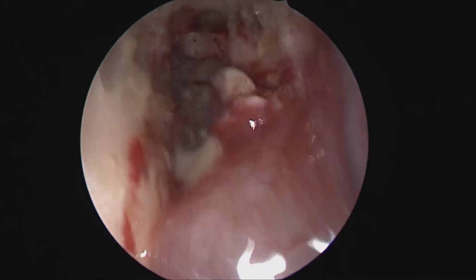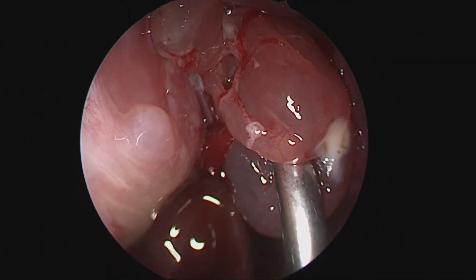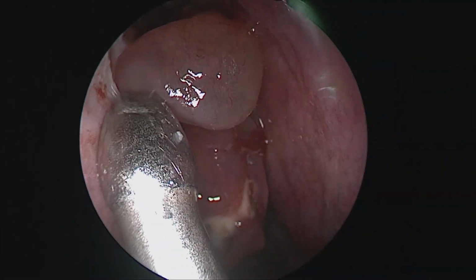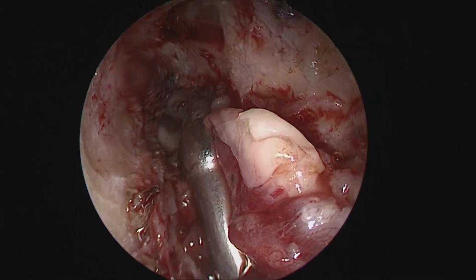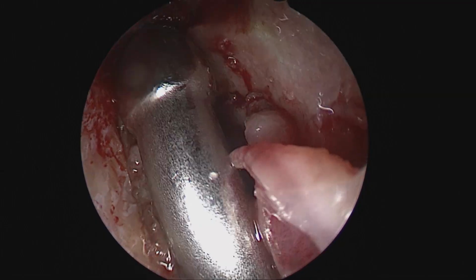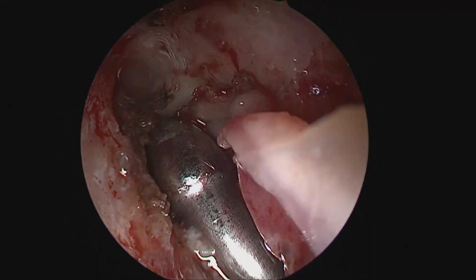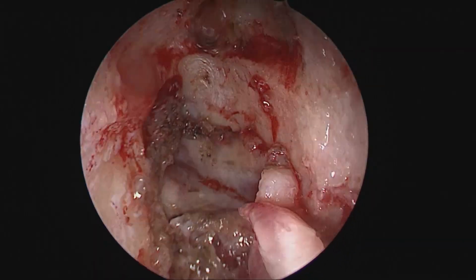As you see here now, there are some purulent secretions which are now being drained once we have opened the frontal sinus and the small frontal sinus proper. So those secretions and that mucopurulent discharge can be drained. And then we see that, with an olive tipped frontal sinus suction, we are navigating the erstwhile frontal sinus space. And you see here that this frontal sinus is very small. It's almost rudimentary with no space.